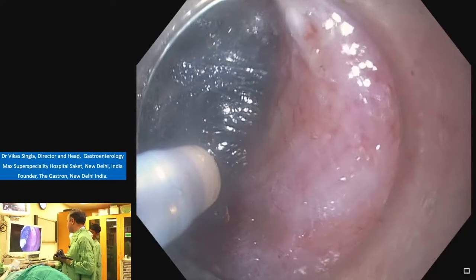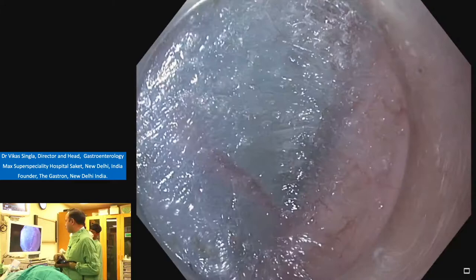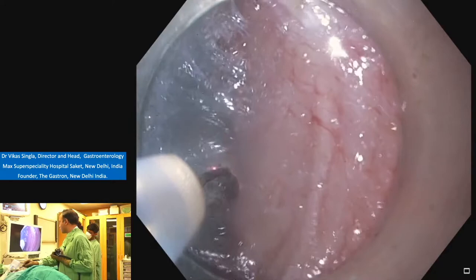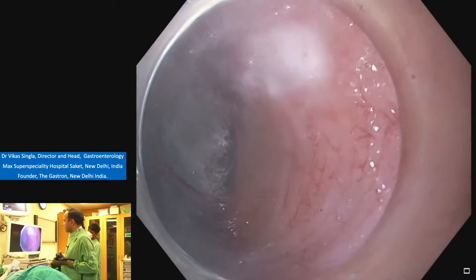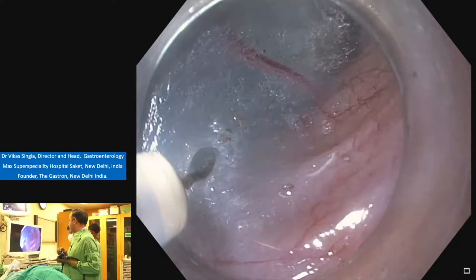Inject. And the setting we use is mainly for coagulation. And whenever there is a bleed or you want to do hemostasis, we use the soft coagulation. Out. And the accessory we use is the TTJ needle knife. It's a TTJ. We can see the tip is triangular and we can inject. It has jet function also.